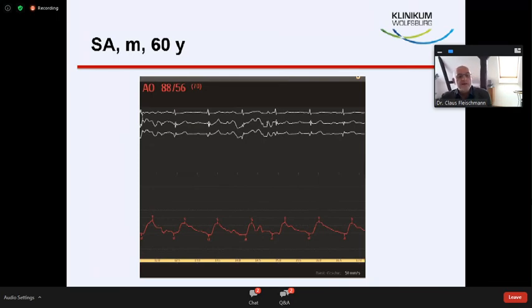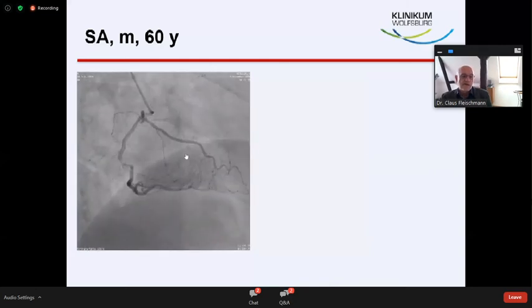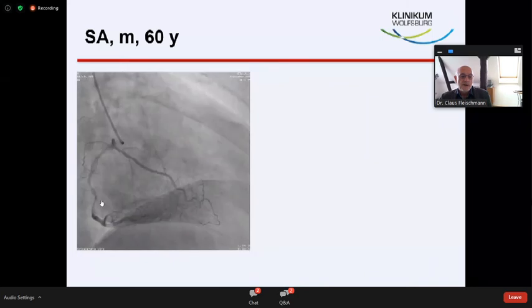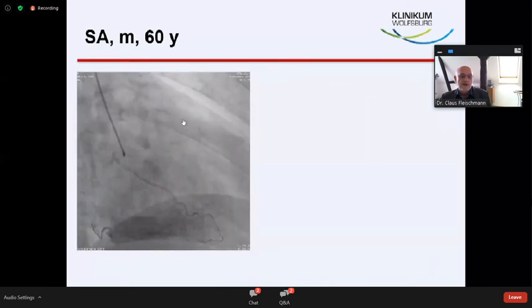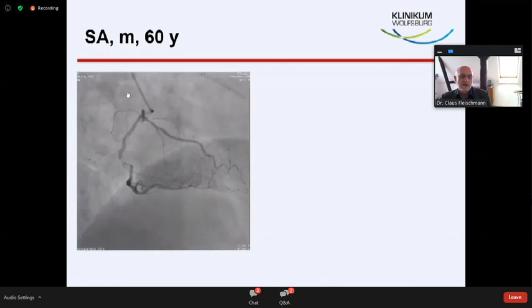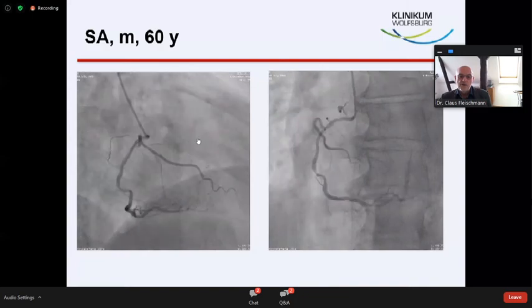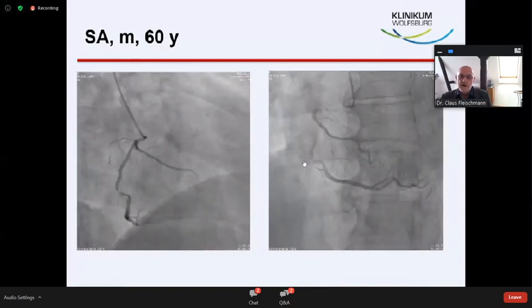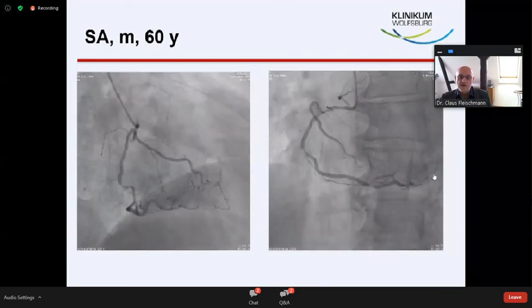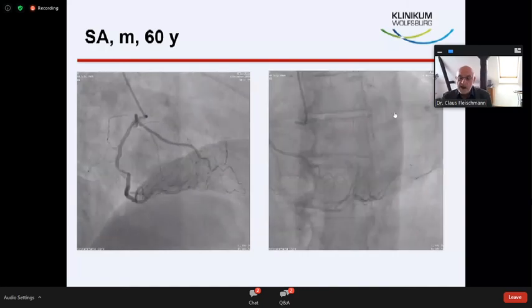And angina also, so we started to do the diagnostics, and we found a stenosis in the right coronary artery, but we have to look closely. What we see is a lot of collaterals to the left system, and you see the calcification near the ostium of the left, and in the other plane, we can confirm this. We have the right coronary artery high-grade stenosis, and we see collaterals, and we see a lot of calcification at the left main ostial area.